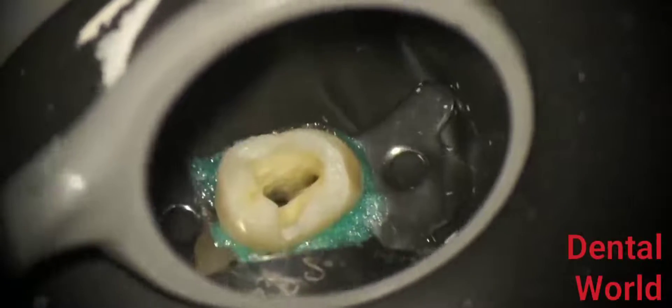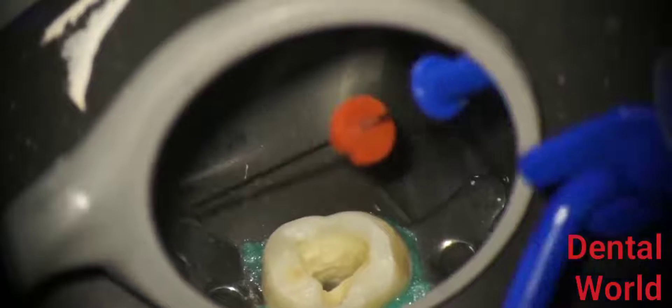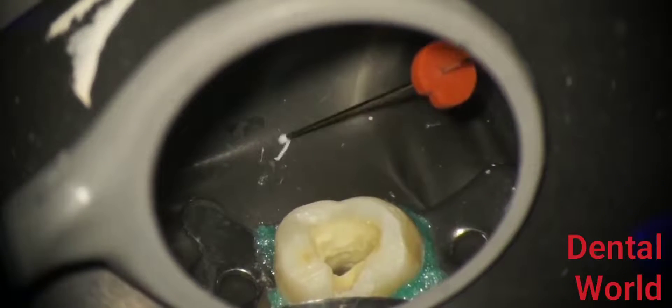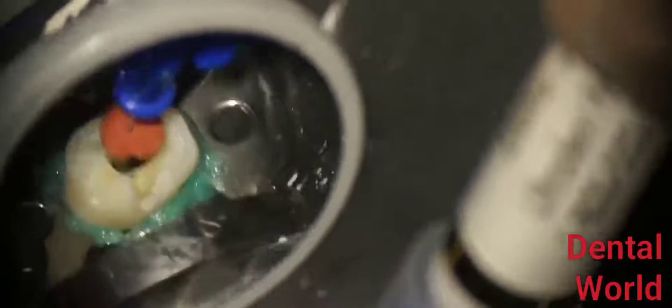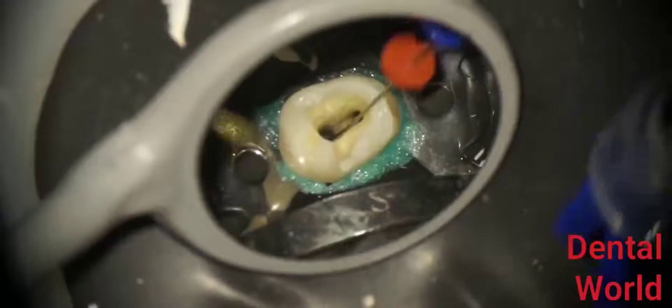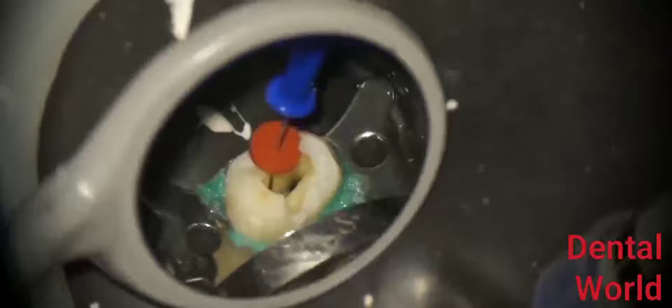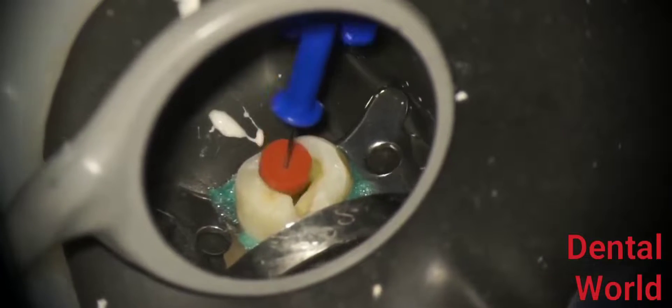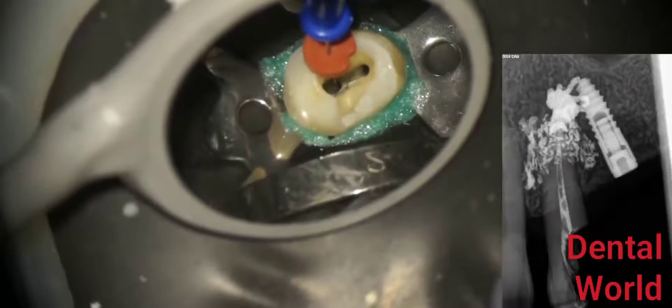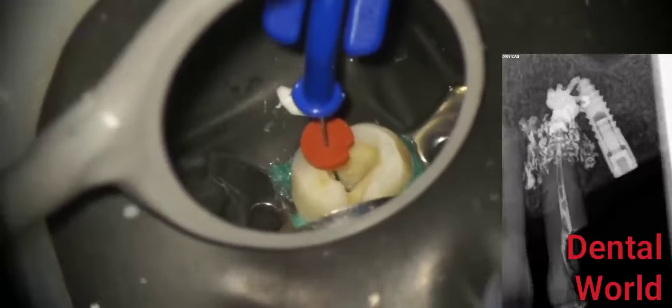Select the Navi tips and place them in the canal. First, adjust the stopper, then inject a little bit outside the tooth to make sure it's flowing, because sometimes Navi tips do get clogged. Once you know it's not clogged, insert it into the canal and adjust the stopper to make sure it's within the working length. The second step is to make sure it's not binding in the canal. If you look closely, you can see the needle is actually binding. If it is binding and you start injecting, you'll get the kind of clinical scenario seen on the radiograph on the right side. Make sure it moves freely, as you're seeing right now.